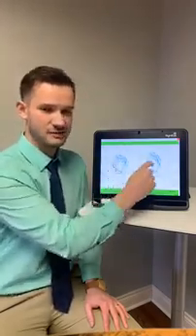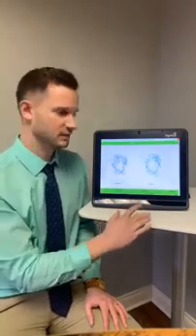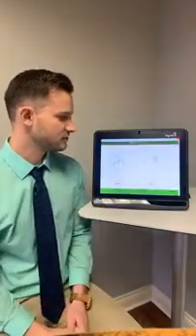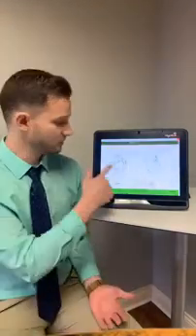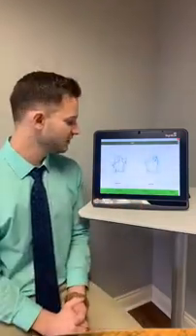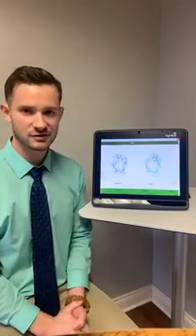The dot's moving constantly and the patient needs to track it the entire time for about 10 seconds or so. We can see as I replay this video, this patient struggling. It should be a perfect circle every time, every time around making a perfect circular shape. Struggling right here to coordinate both eyes together in a circular fashion.